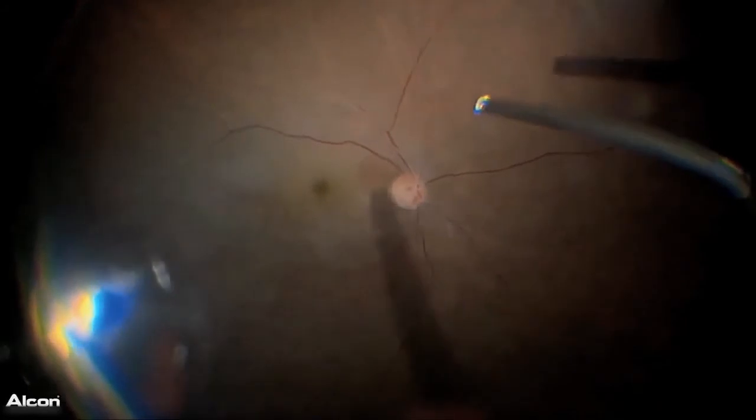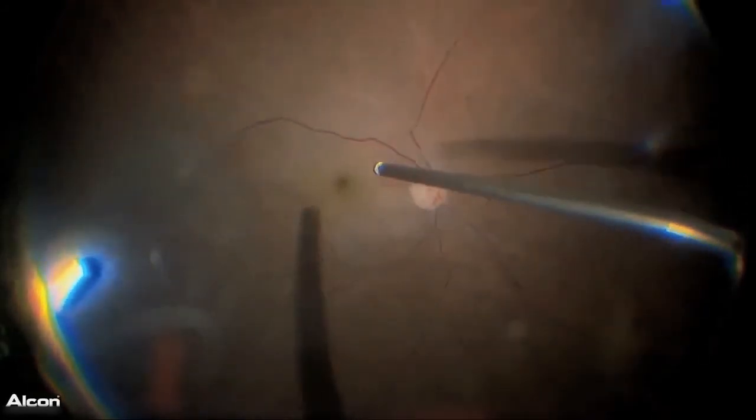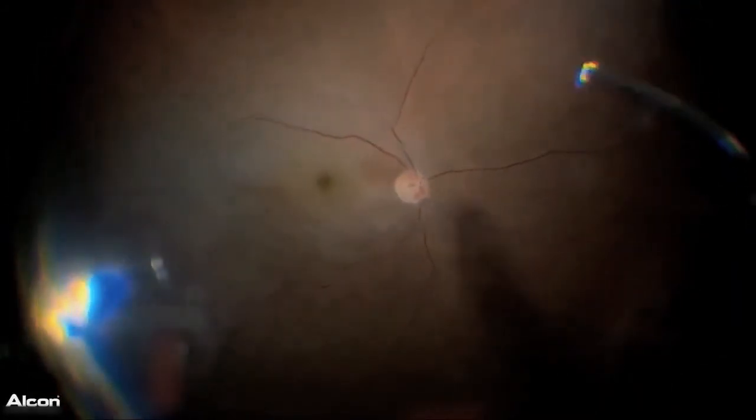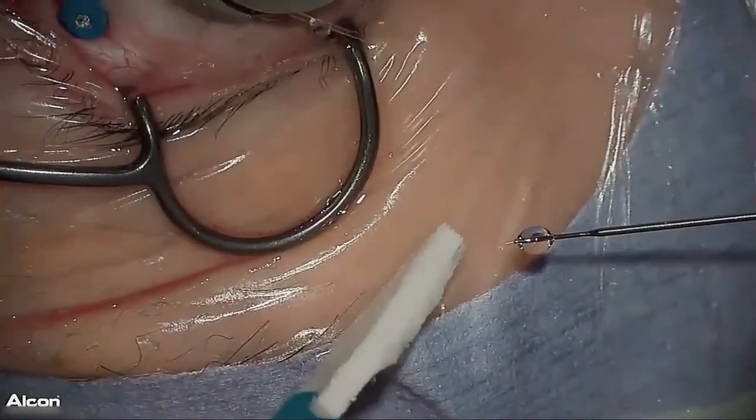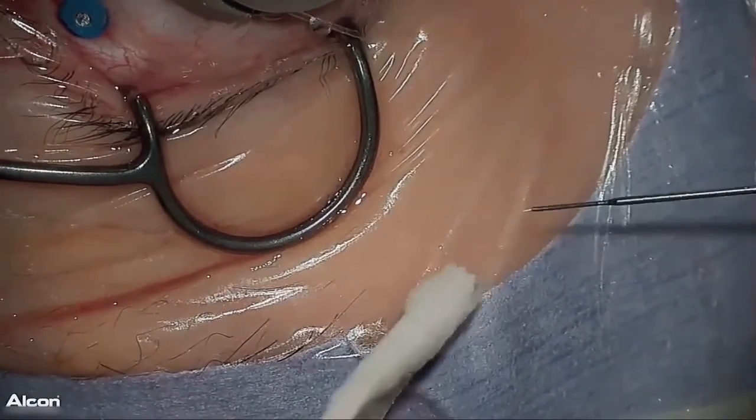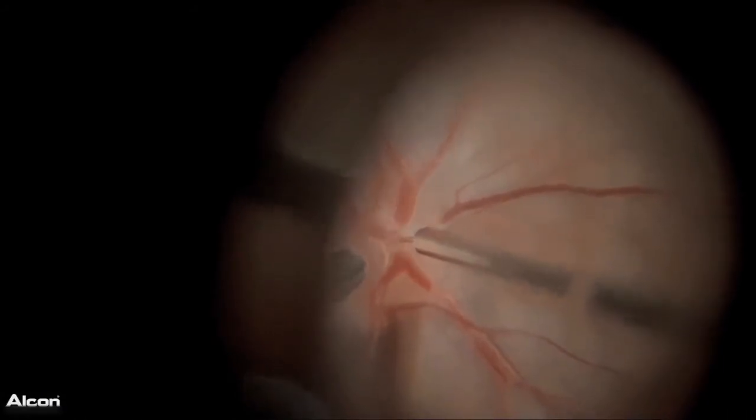This is the last case, and can you guess which disease? In this disease, we can see a cherry red spot. This is a patient with CRAO. This patient visited our clinic 24 hours after onset. So I decided to perform a cannulation for this patient.